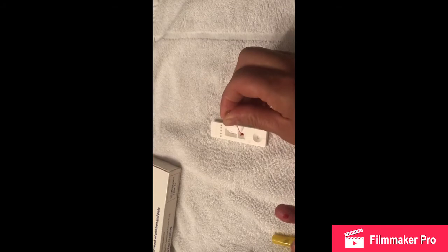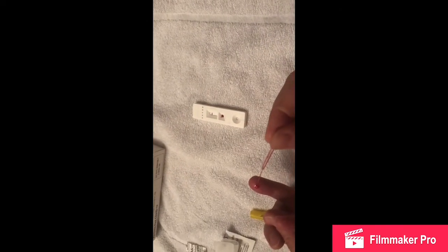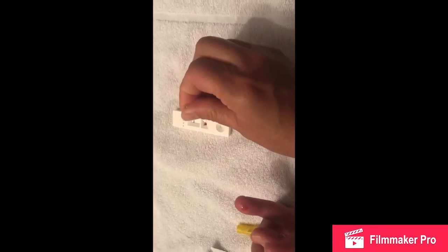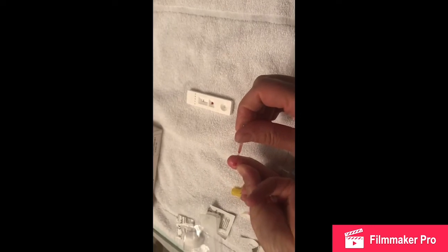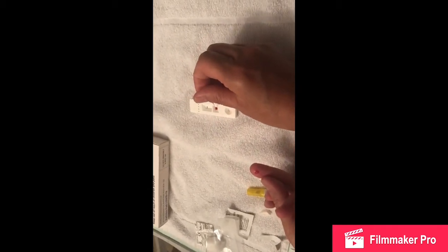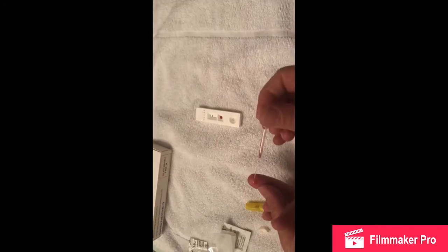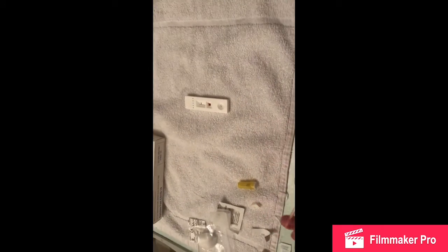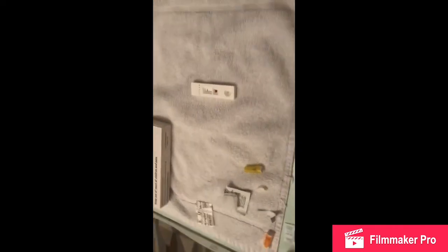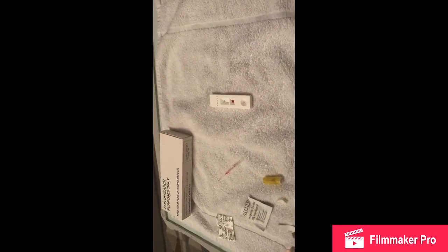I think that will do — maybe a little bit more just to make sure there's enough blood there for the test. All right, what we'll do now is put that down, and we'll wipe the finger a little bit just to stop the blood coming out, just like that.